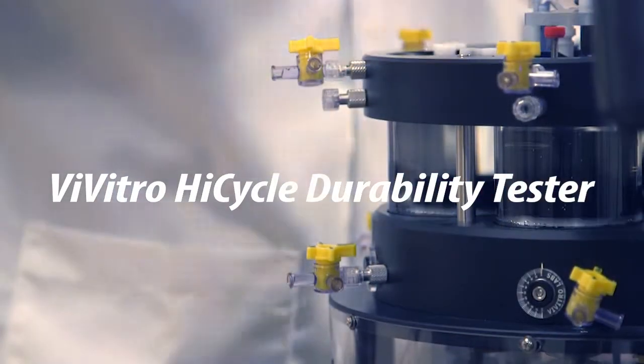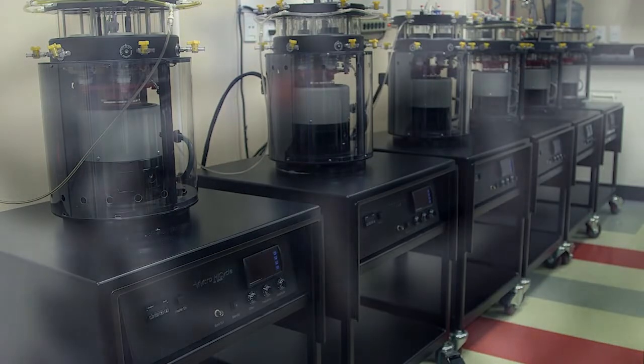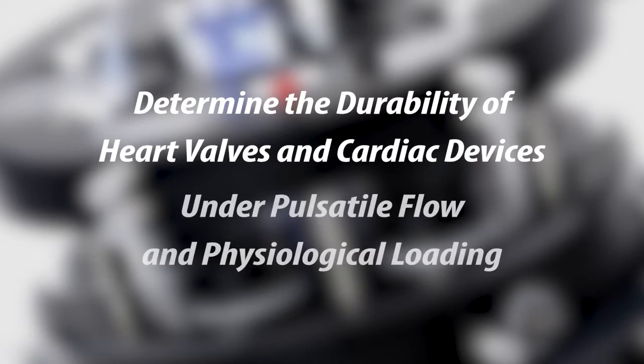The Vivitro High Cycle Durability Tester is an accelerated wear tester featuring a robust, compact design, flexibility, and customization. It determines the durability of replacement heart valves and cardiac devices under pulsatile flow and physiological loading.